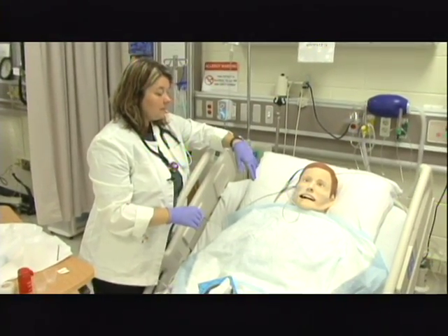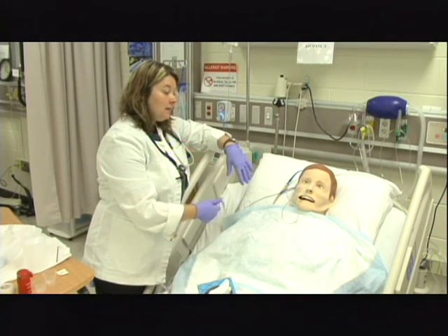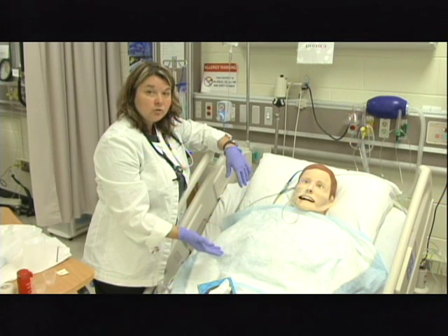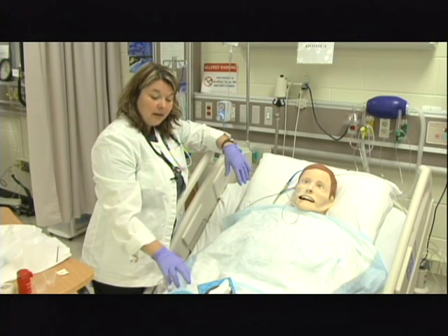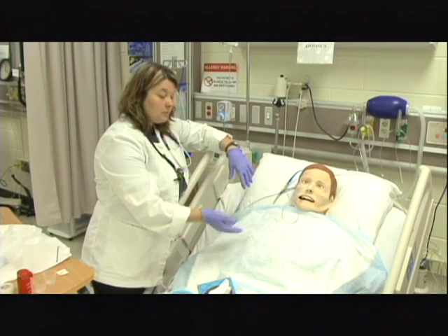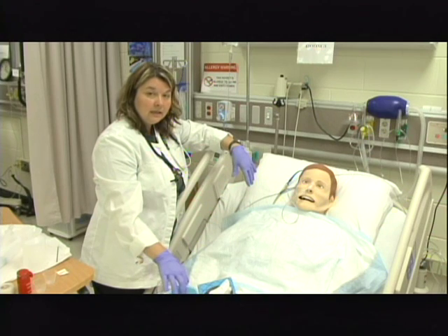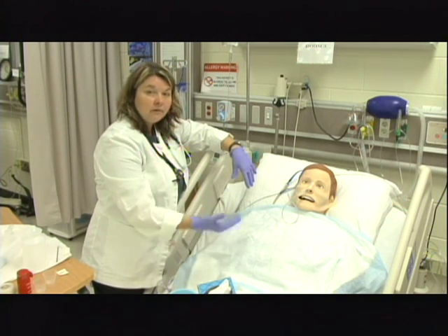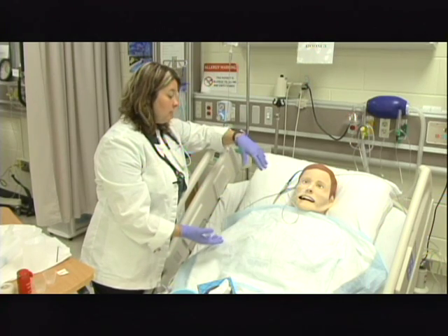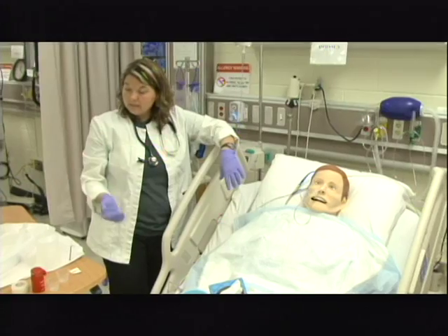So at this point, I need to make sure that he tolerated the medications and how he's doing. Anything that I pre-assessed, I would need to go back and reassess. I would also keep the emesis basin close by, because sometimes when your patient's on suction and then you put things down there and you turn the suction off for a little bit, they can get a little nauseated. I could have pre-medicated him for pain or nausea if he was having any of those things before I gave him the medications. At this point, I'm done giving him his medications.